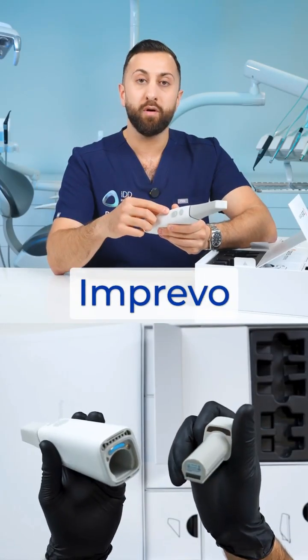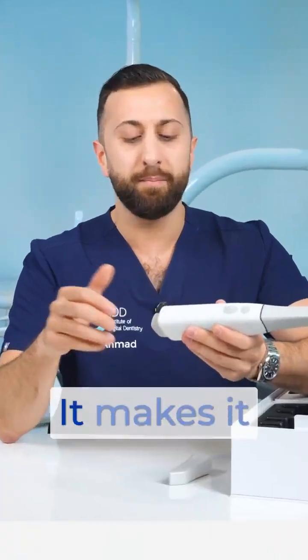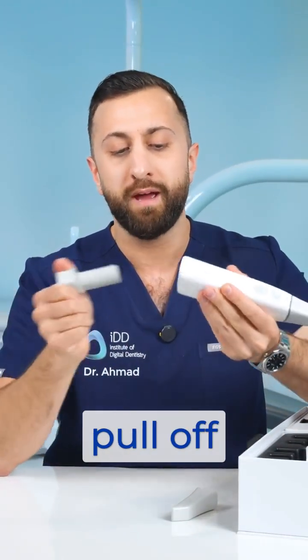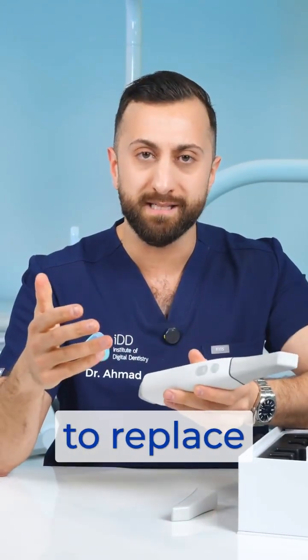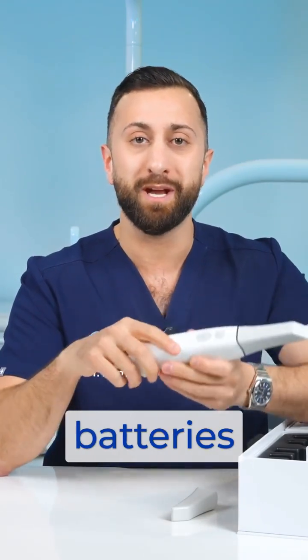These batteries connect to the Imprevo magnetically, and I think this is a nice quality of life benefit — it makes it a lot easier to just pull off and put in batteries if you need to replace them. But they are pretty tight in there; you saw how hard I had to pull these batteries out.